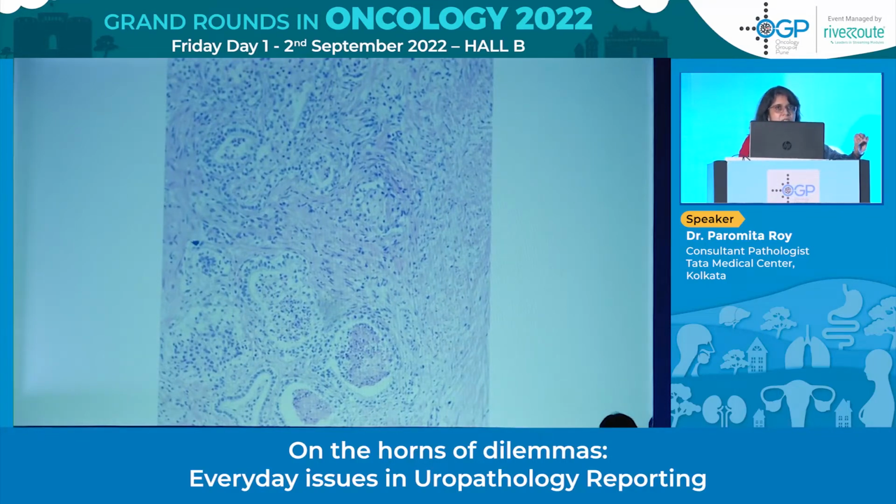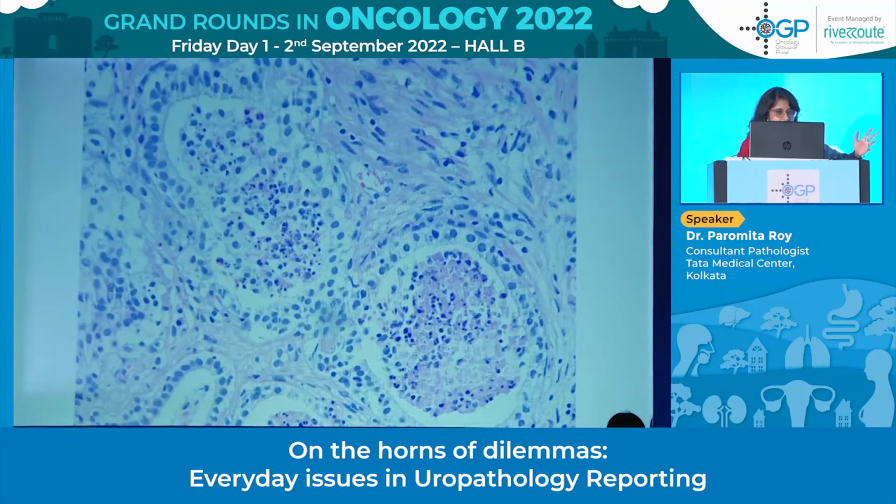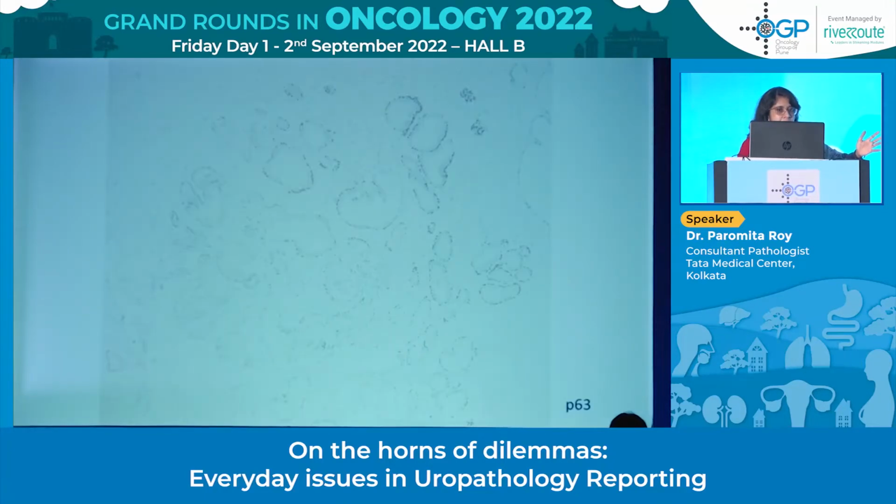It can mislead you, and especially when you have a known diagnosis coming from a good lab, you tend to be complacent, you tend to doubt yourself because some other pathologists had called it Gleason pat of 3+5. 3+5 is a high-grade cancer. The management is very different from a 3+3 or a benign. So some of us felt it was 3+3 based on morphology.